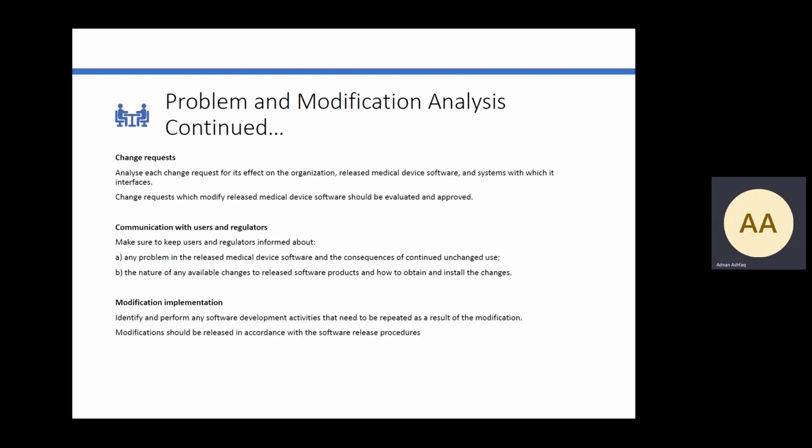Then we have modification implementation. Identify and perform any software development activities that need to be repeated as a result of the modification. Modifications should be released in accordance with the software release procedures.